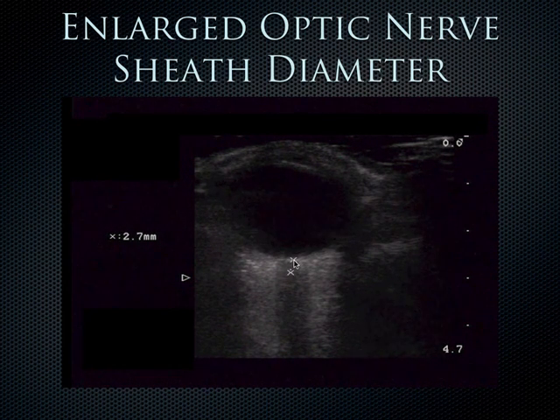You measure from the choroid of the eye, the back of the eye, 3 millimeters. You wait until that number reaches 3, and then you bring up another caliper, and at that level you measure the width of that sheath, that shadow that comes down.